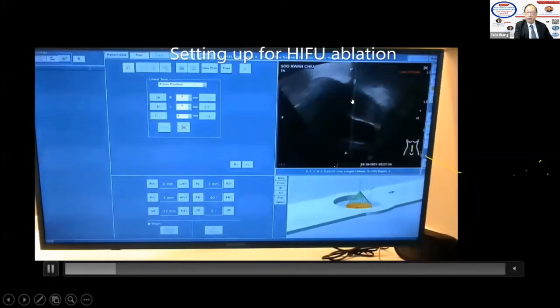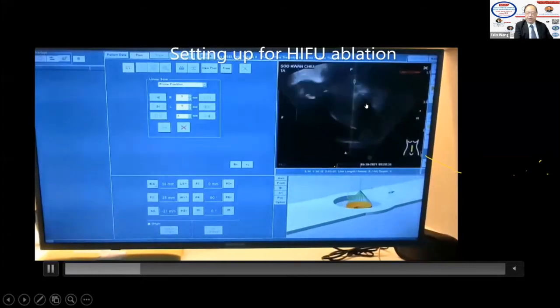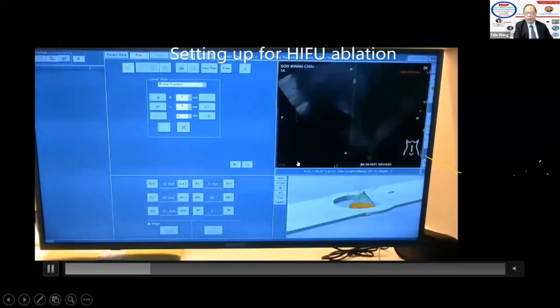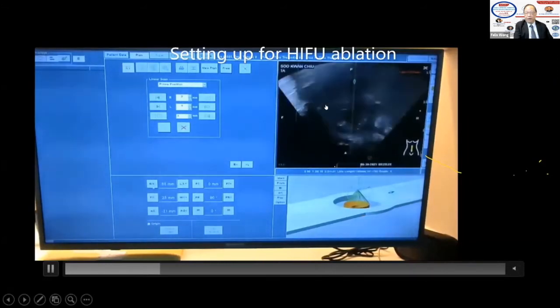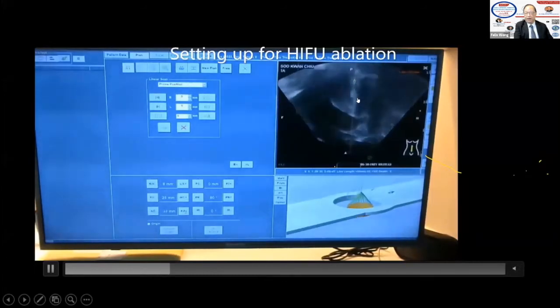Now, you see in the Zoom, when we take the video, it's not clear enough. So later on, I will show you more clear pictures from some of the recordings I have from Chongqing. However, you can still see what I am doing. I'm going to explain it. And we are moving because it's not going to be so clear. I'm using a faster speed.